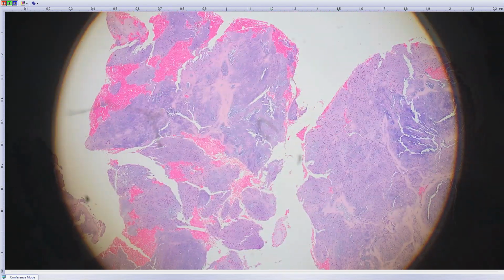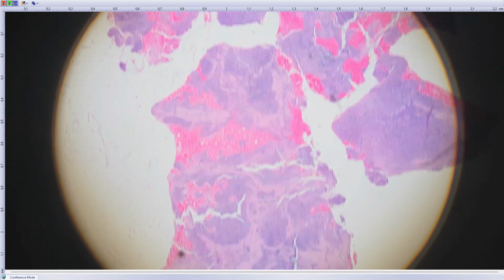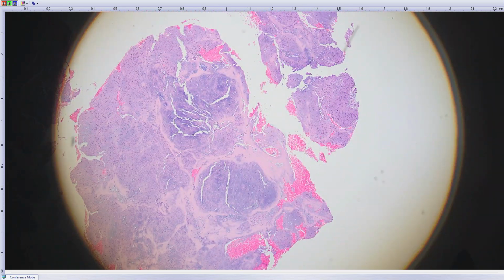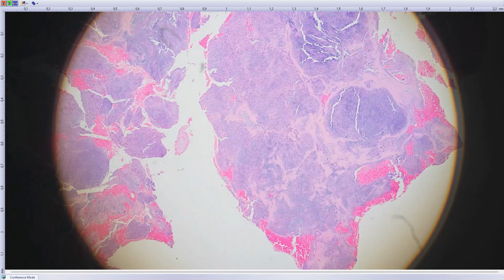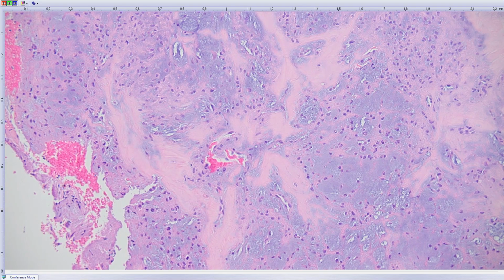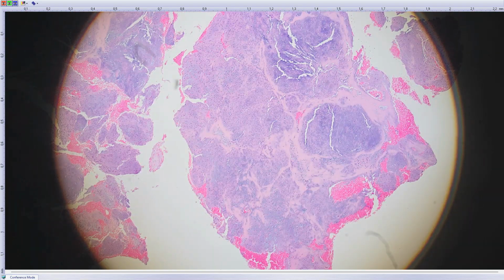Another useful feature is that, although it's hard to see here due to the fragmentation, between the lobules are fibrous septae, which often contain prominent vessels. I don't see any good example here. Actually, so far all cases contain the same THBS1 fusion.